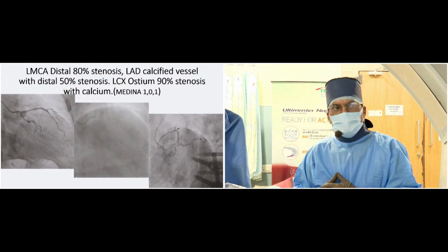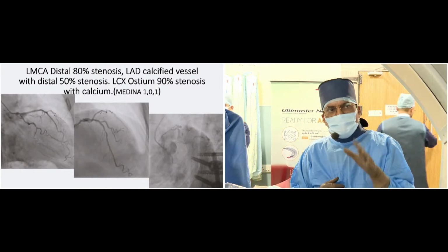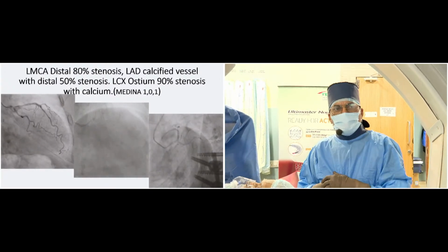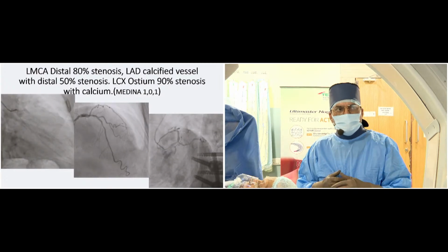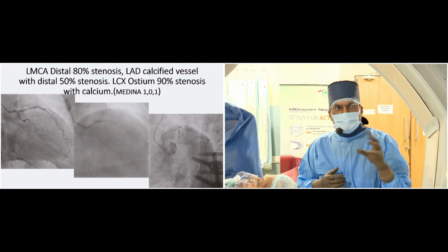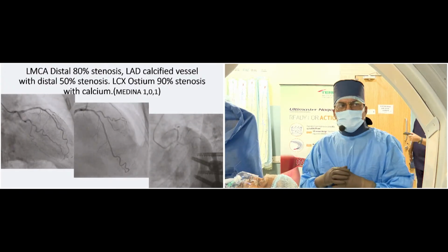So our intention is to do this, and at the end of the procedure I am going to explain the previous procedure. That was also a very complex procedure, where we did orbital atherectomy, angioplasty, plaque modification, and stenting using a guide liner. So, all those steps aside, straight away we will go to today's live case transmission.